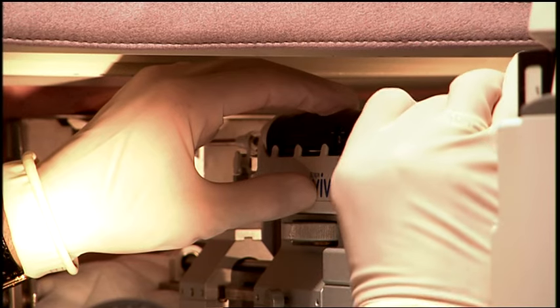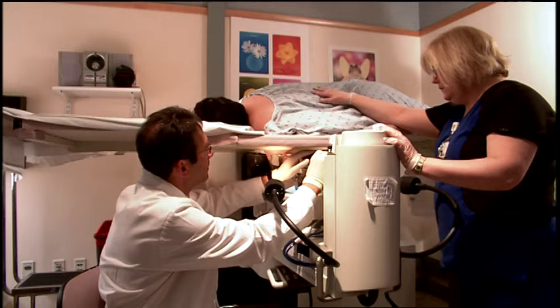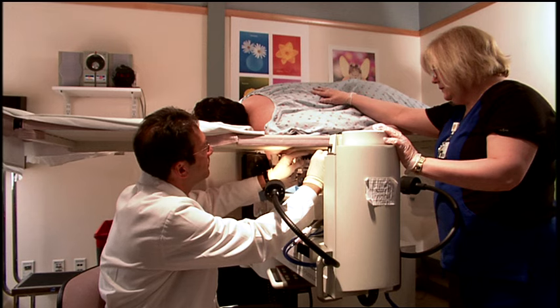The radiologist takes multiple tissue samples from the area of concern. It is very important that the patient remain very still throughout this process.